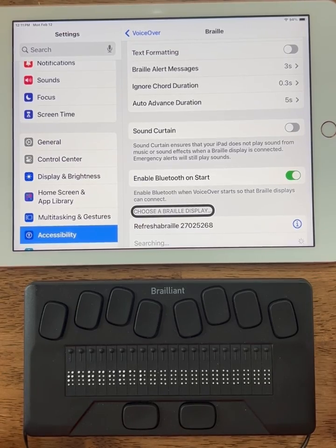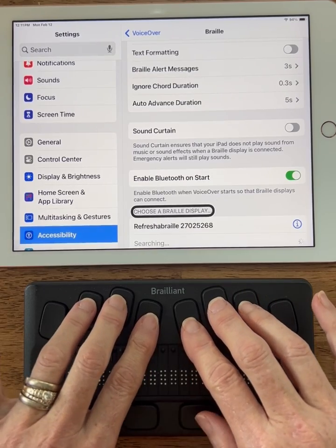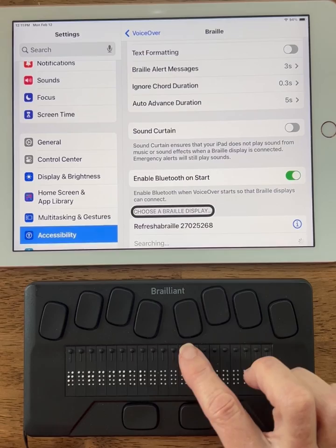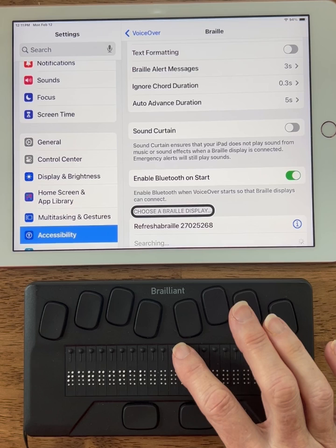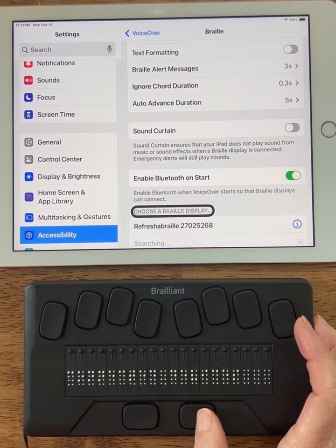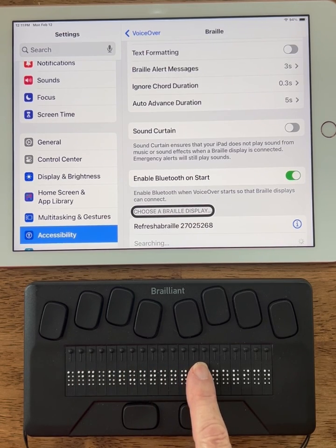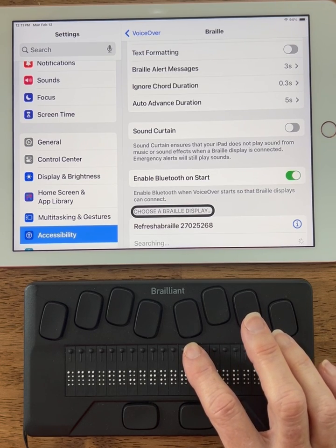It opened up to terminal. If it did not open up to terminal, you can press the 4-chord — which is 1, 2, 3, 4, 5, 6 spacebar — and that will take you to terminal from anywhere on the Braille display. I'm going to use any routing button to select. The routing buttons are the little round buttons above the Braille. I'll press any routing button and navigate to 'Add Bluetooth.' I'm going to use my spacebar until I find 'Add Bluetooth Device.' I am on 'Add Bluetooth Device' and I'm going to press any routing button to select that.